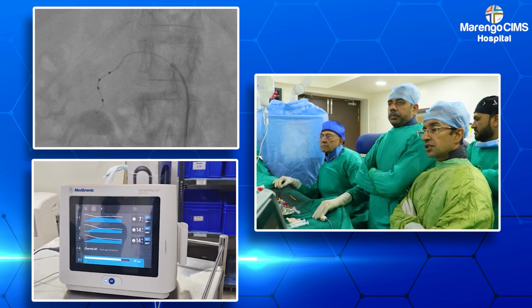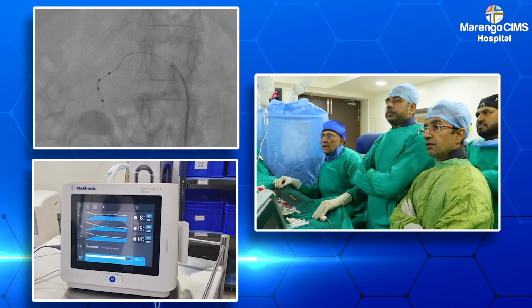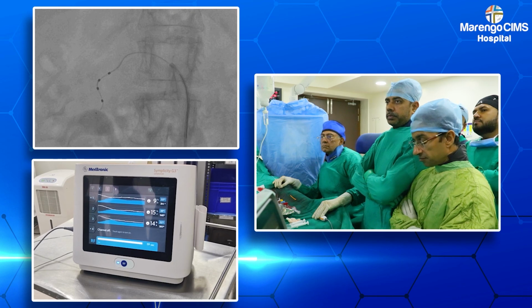Seconds, 15 seconds more, 10 seconds more. We have a 14 to 15% reduction in the impedance, as you can see. And now 60 seconds are done.